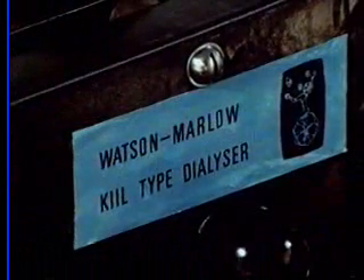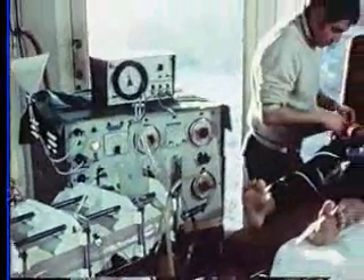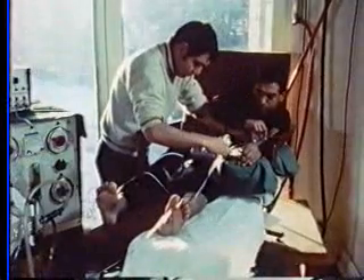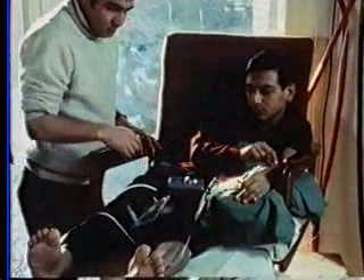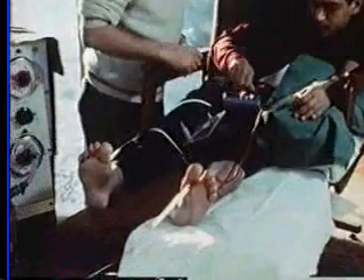The dialyzer is now joined to the automatic dialyzer supply unit. The patient and his brother make the connection between the outflow blood tubing and the fistula needles. The patient controls the blood pump with a switch at his right hand, and we see the blood flowing down the tubing over his foot and towards the pump itself.